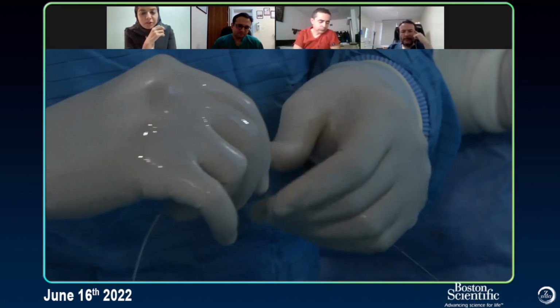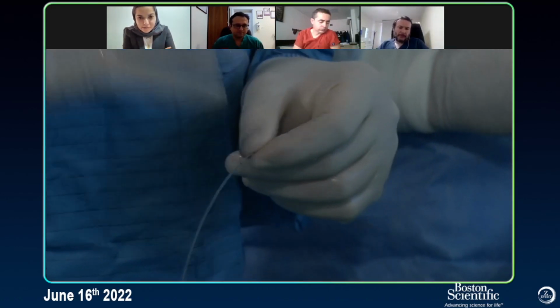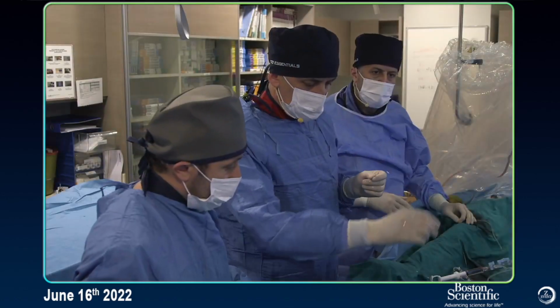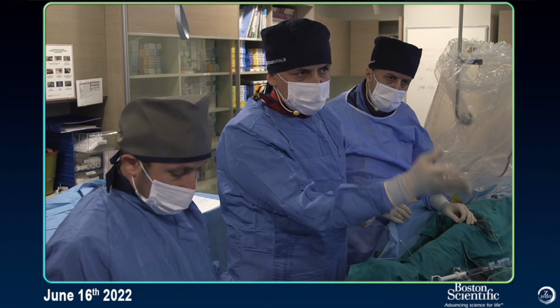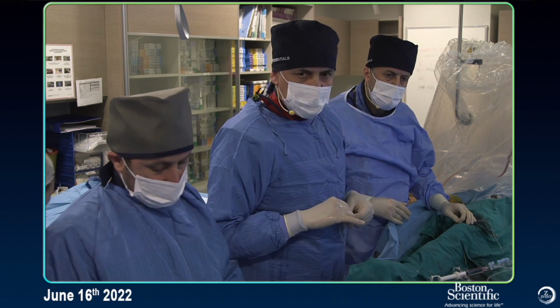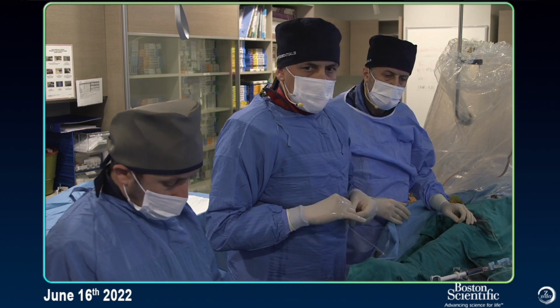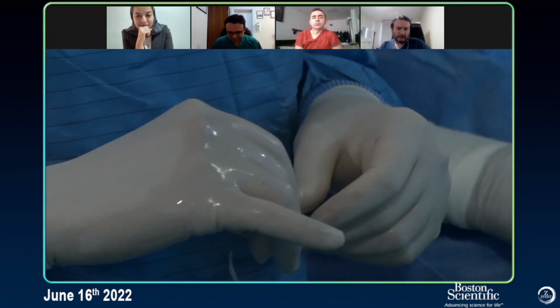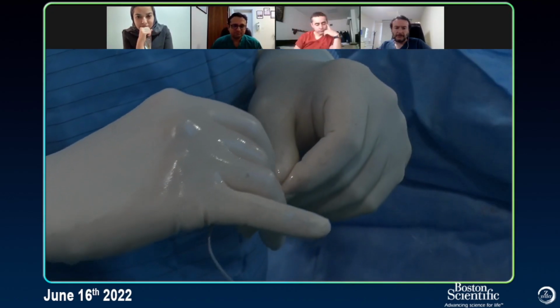And what size burr are you using? Ah, yes, that's a very important question. What do you suggest, first of all? What is the vessel size on the IVUS? The distal is 3. When you go to the proximal, 3.5 to 4. 1.75. Okay, 1.75 because probably your calcium is mainly proximal. So maybe a 1.75 as well. All right. I choose the same 1.75. Yeah, because we can start with the smaller one, but the cost will be doubled. So we choose 1.75 directly.